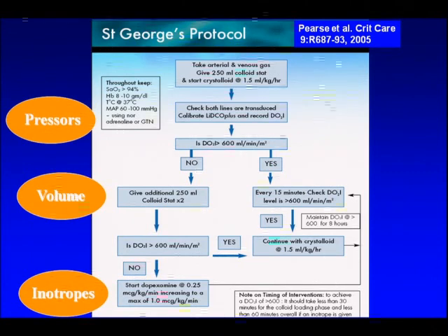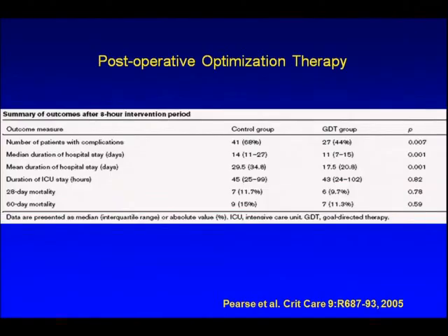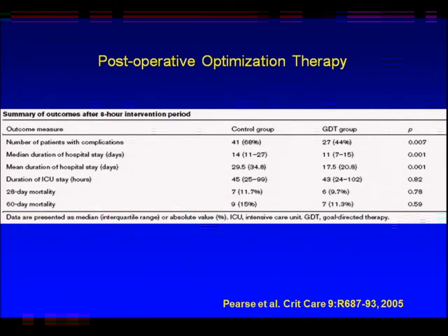Using this fashion of optimization, they were able to show a reduction in complication rates and a significantly shortened hospital stay in these patient populations.